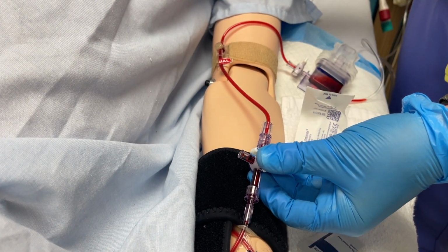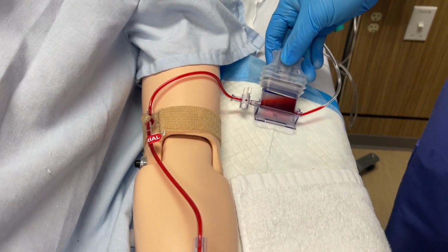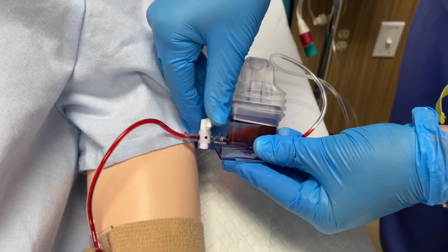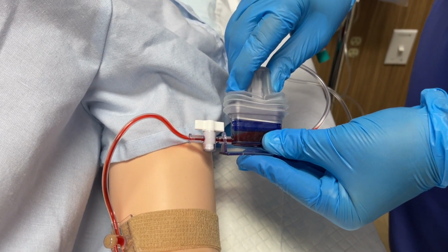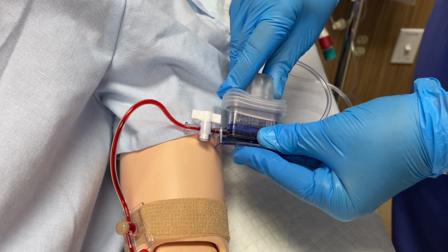You will then disconnect your tube transfer device and prepare to flush the line. First, we must give back our waste. In reverse order from pulling back the waste, we will turn the two-way lever back to its neutral position, opening the lumen of the line. Then, pressing in on the two tabs, we will gently give back the waste that is collected in the line.